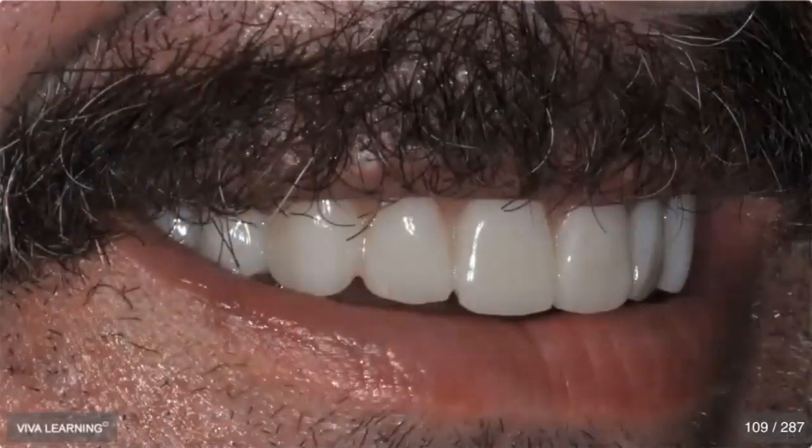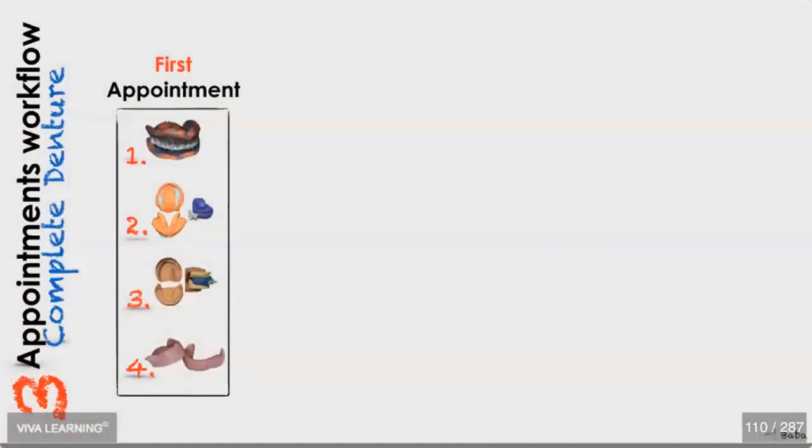And notice the beauty of CAD/CAM is that the teeth are in one piece. There are no voids between the teeth. The teeth are strong and they look very aesthetically pleasing. Now, the Ivoclar library is provided here for the teeth, so you can either have Bluline, you can have Phonares, you can have SR Vivodent, so you can pick whatever you want from the library.